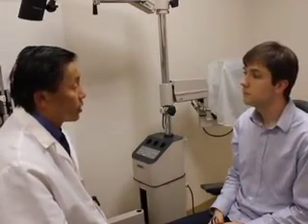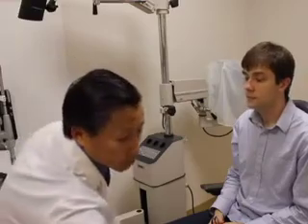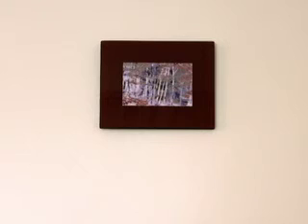Darken the room to maximize pupillary dilatation. Note that the room is not darkened here for the purposes of the video. Designate a point at least 1 meter away for the patient to look at. Patients are better able to fixate on an image or object than a blank wall.